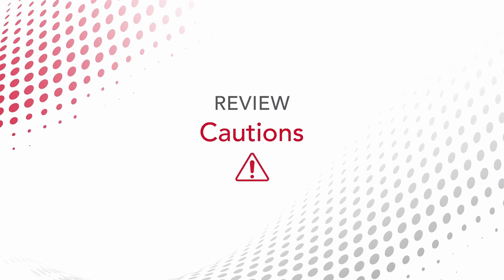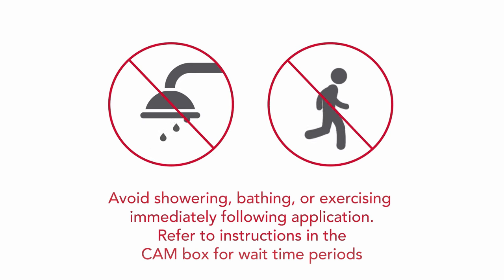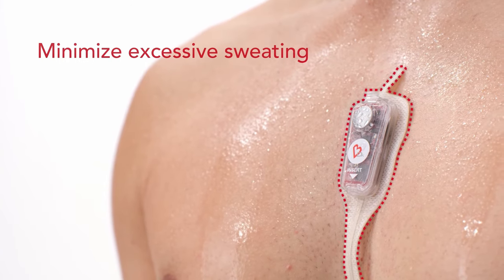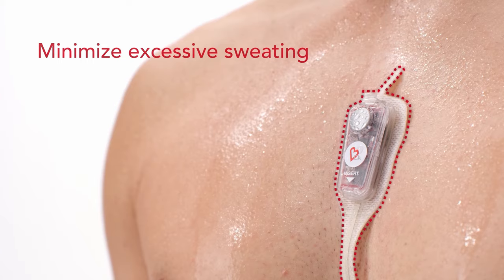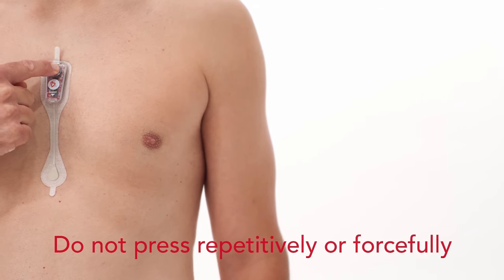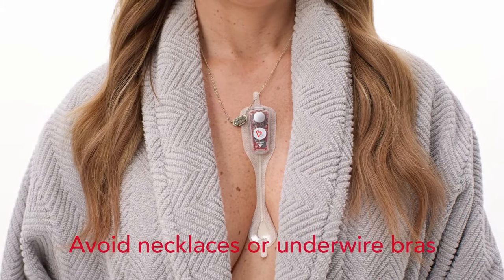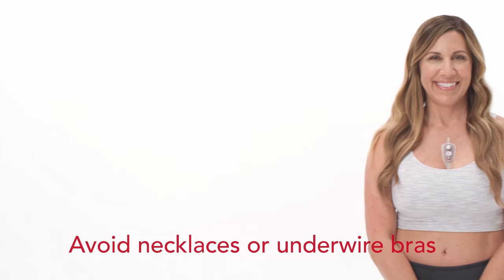To ensure optimal ECG recording, reinforce the following cautions with the patient. Avoid showering, bathing, or exercising following application. For the remainder of the wear time, avoid activities or environments that result in excessive perspiration, as this may result in a decreased period of patch adhesion and monitoring. When showering, avoid exposing the monitor directly to the water stream. Do not press the event button repetitively or forcefully. Avoid wearing necklaces or underwire bras, as they can disrupt recording. Sports bras or no bras are recommended during wear.